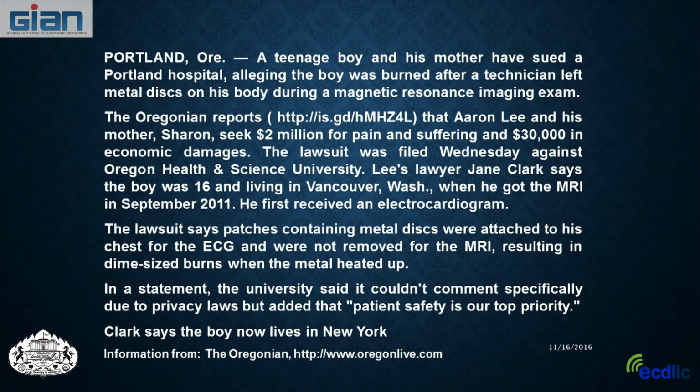So they were looking for $2 million for pain and suffering and $30,000 for damages. They were suing this MRI center because of this incident. So this is, again, something you need to worry about: burns on the body.